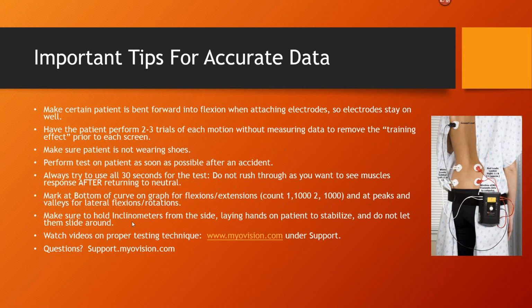Make sure to hold the inclinometers from the side. One thing that's hard to do is that John Gerhardt was a genius, and he came up with this idea of doing the range of motion from the side.